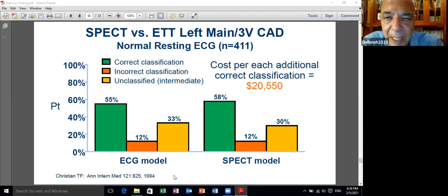زمان قبل ما يبقى عندنا الجايد لاينز اللي حددت مين في الاكيوت كوروناري سندروم يروح للقسطره ومين اللي ما يروحش للقسطره، وفي الاغلبيه ان اغلبهم بيروحوا للقسطره ان لم يكن كلهم، كنا العيانين اللي عندهم unstable angina after they get stabilized we exercise them 3 مرات. المره الاولانيه قبل ما يخرج عشان نشوف ايه التريتمنت اللي ياخد، فكنا بنكسرسايز them to 70% of the maximum heart rate. This is sub maximum ما توصلش ل 80.